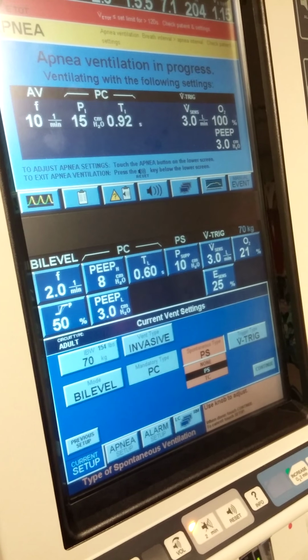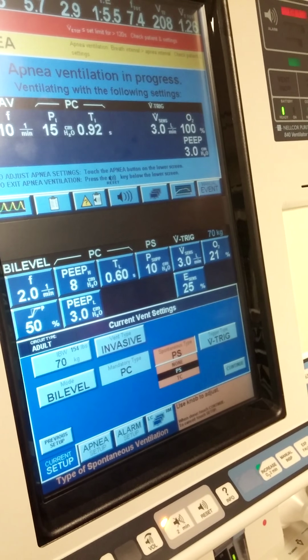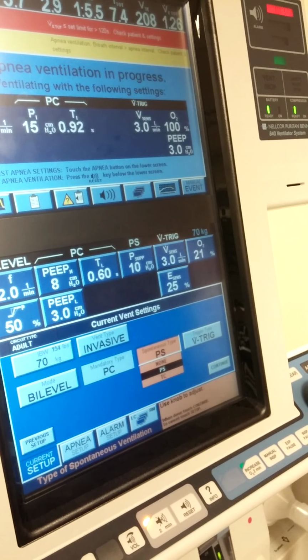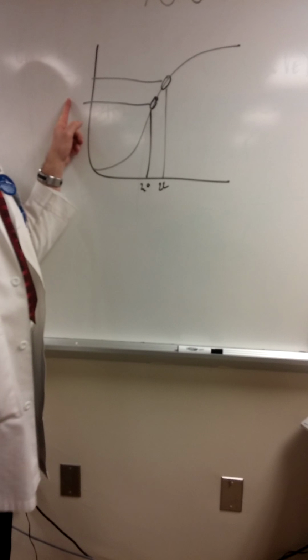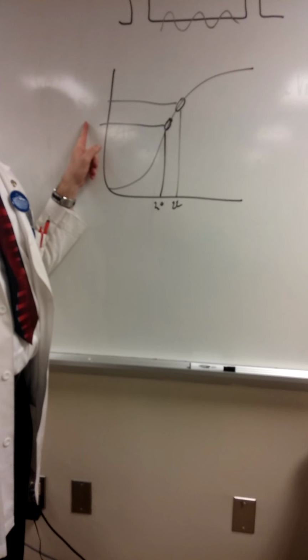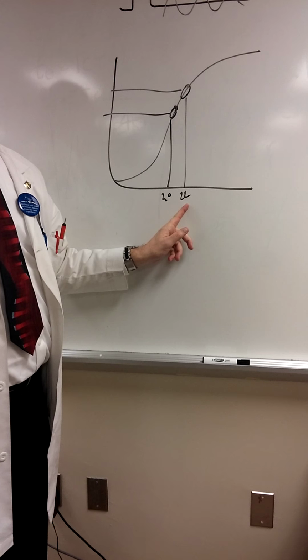Now, do we need to put pressure support on? That's the other option you have: you can use tube compensation as opposed to pressure support. In reality, and I drew it on the board over there, think of the little circle there as a spontaneous breath, and I'm at 20 of pressure, breathing spontaneously. I'm delivering a certain tidal volume. If that tidal volume's too low, I can add pressure support to that. But the bigger question is, why not just go up on your pressure?